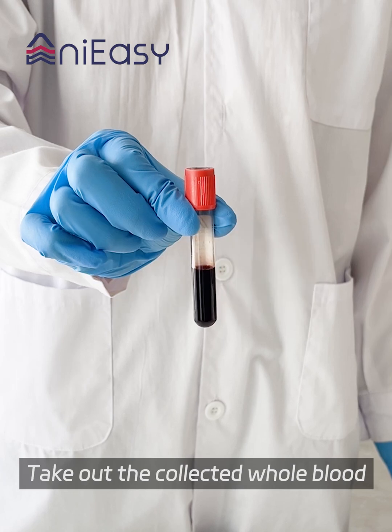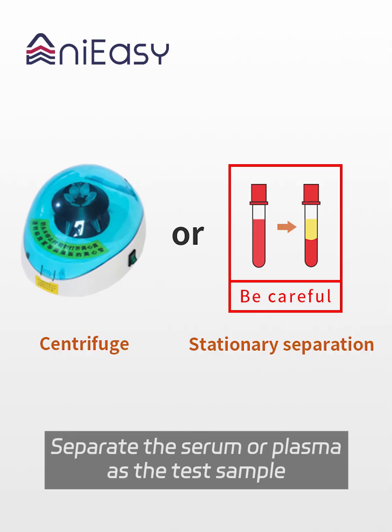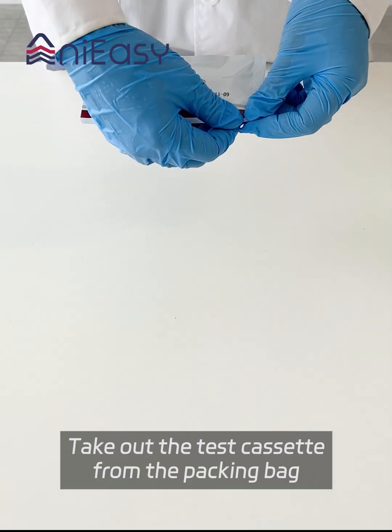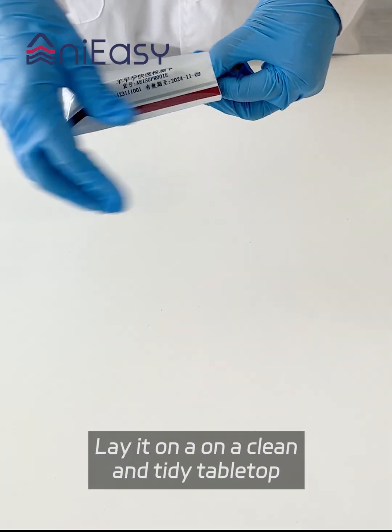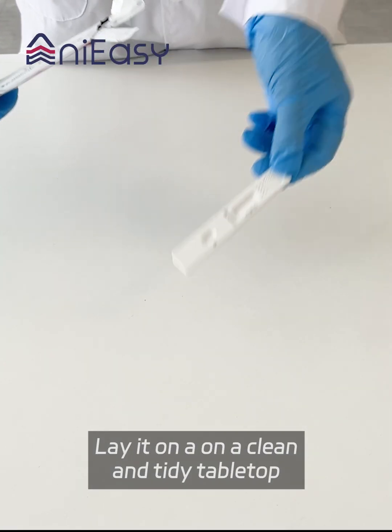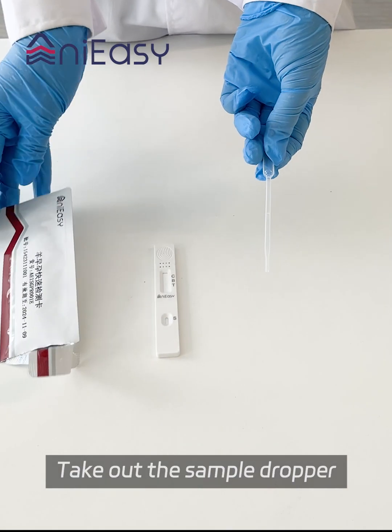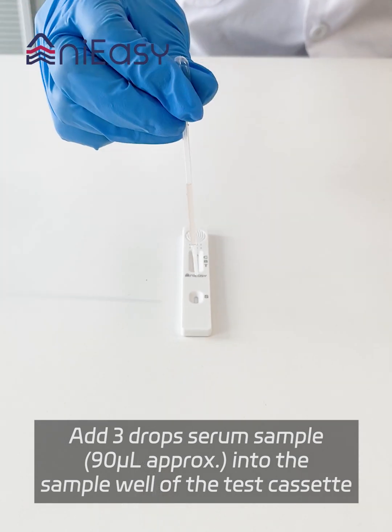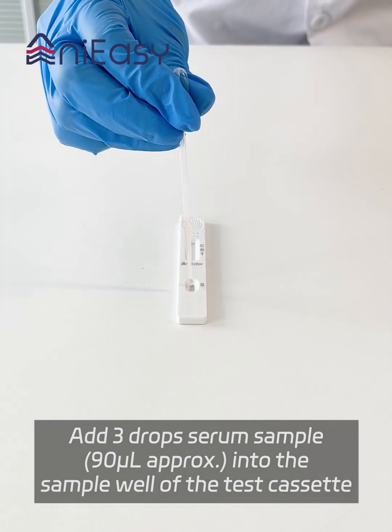Take out the collected whole blood and separate the serum or plasma as the test sample. Take out the test cassette from the packing bag and lay it on a clean and tidy tabletop. Take out the sample dropper and add 3 drops of serum sample — approximately 90 microliters — into the sample well of the test cassette.